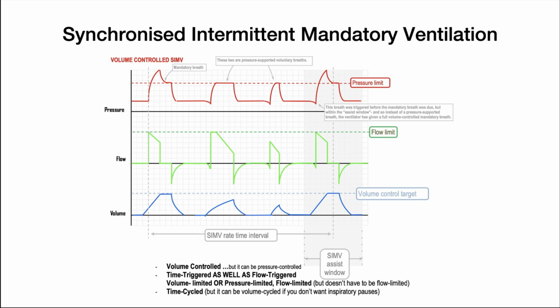The use of SIMV may reduce sedation requirements. In the ICU, SIMV is sometimes used as a weaning mode, but it can prolong mechanical ventilation and is therefore not routinely recommended for weaning. The pre-hospital utility is that as muscle relaxation begins to wear off, it leads to less ventilator dysynchrony.